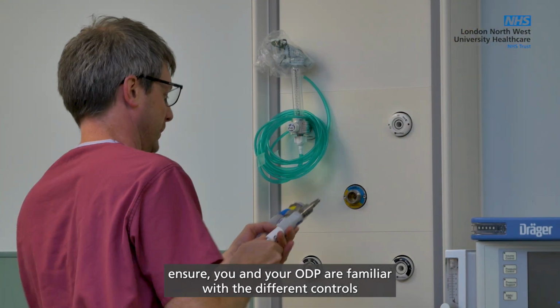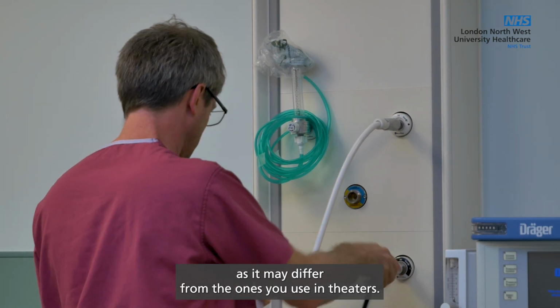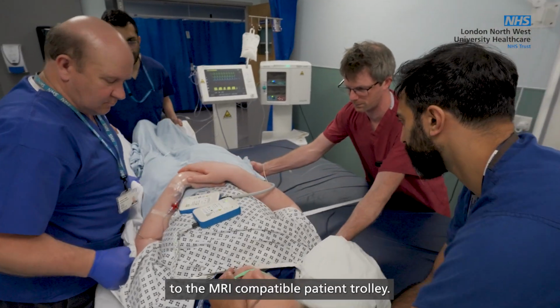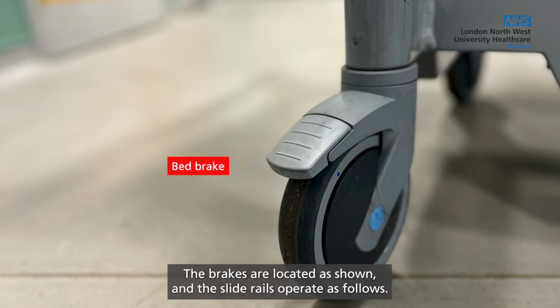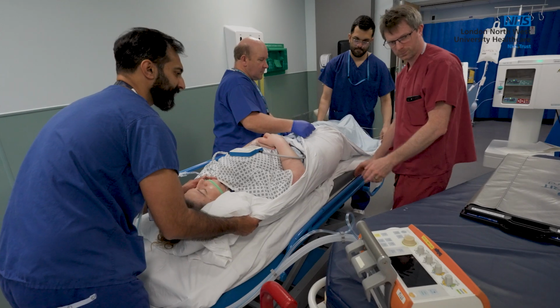Ensure you and your ODP are familiar with the different controls, as it may differ from the ones you use in theatres. We must now transfer the patient from their hospital bed to the MRI compatible patient trolley. The brakes are located as shown and the side rails operate as follows.